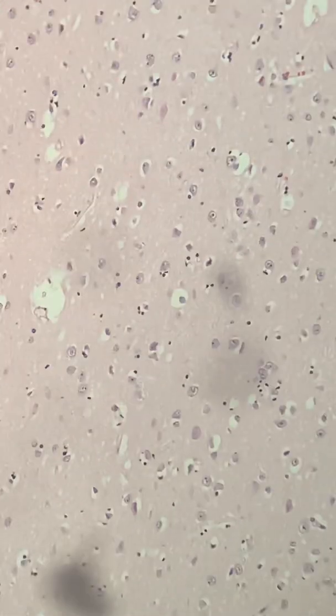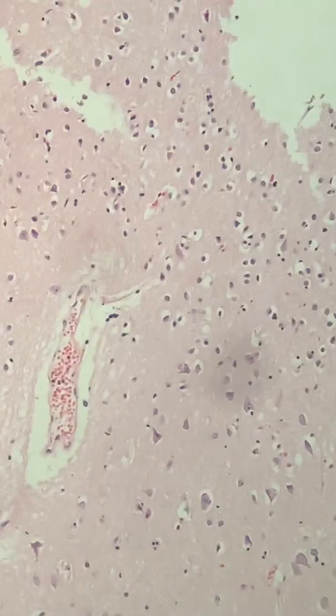I usually take several sections of the brain. I'm not going to go through a lot of the sections of the brain because it was very normal brain, and I think I showed you the gross because I like to keep my stuff transparent. So people go, oh, he doesn't know what he's talking about. And if somebody wants to argue that this is abnormal brain, so be it. This is very normal brain by histology, and even perhaps functional during life.